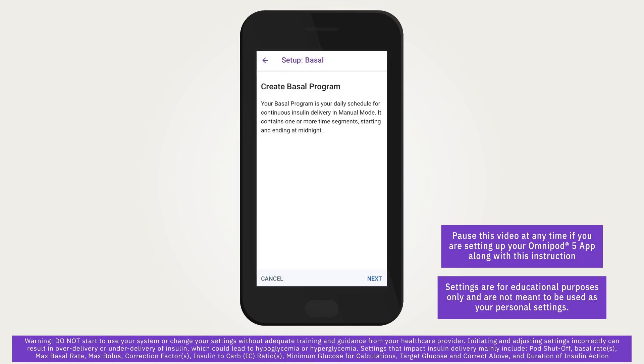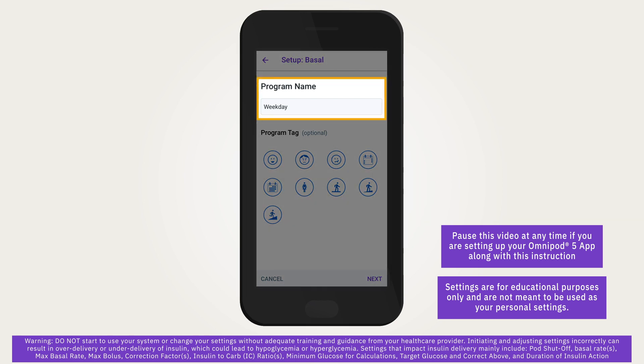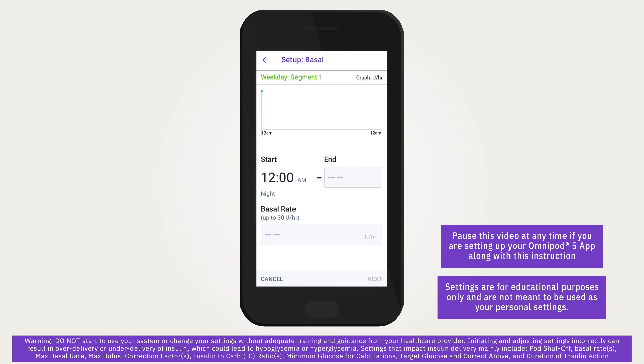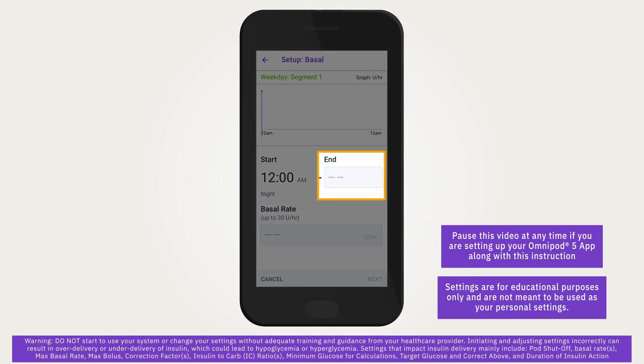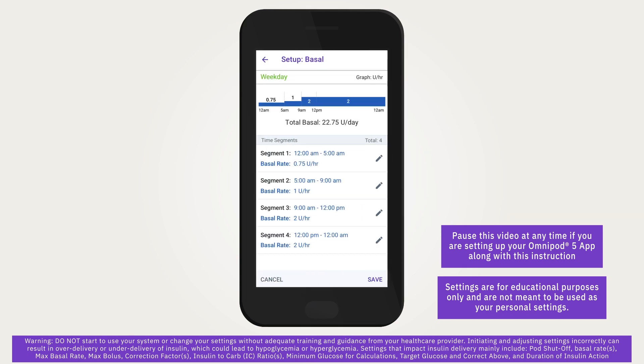This will set the adjustable upper limit of manual mode basal rates. The next step is to create a basal program for basal insulin delivery, mainly in manual mode. Tap next to get started. The default name for the basal program is Basal 1. To change the name, tap the program name field and enter the new name, then tap done. Select an optional program tag and tap next. The start time for the first segment is always 12:00 a.m. Tap the end time field and scroll to the desired end time, then tap the basal rate field and scroll to select the basal rate for the segment.